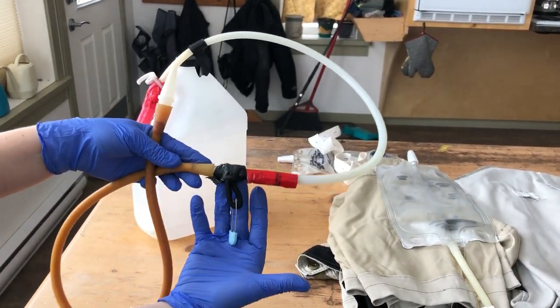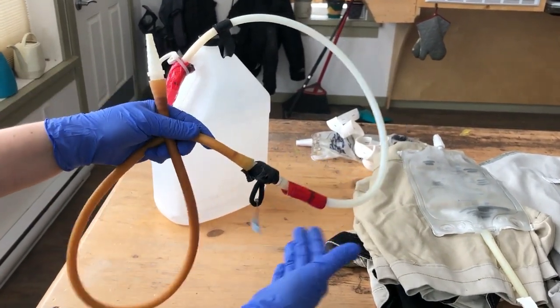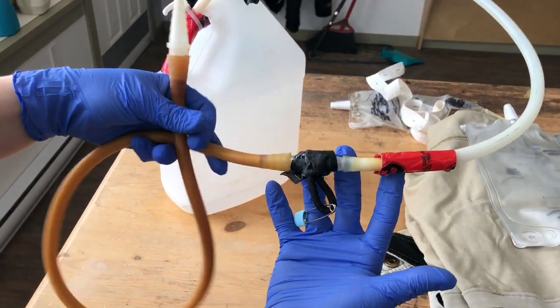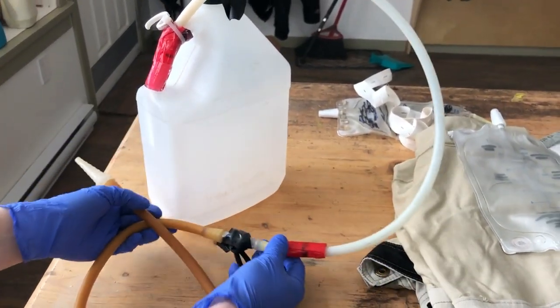The surgical tubing is nice and flexible, and you can hook it up to your catheter system easily and don't have to worry about crimping or twisting. So that's about it for urinary drainage.